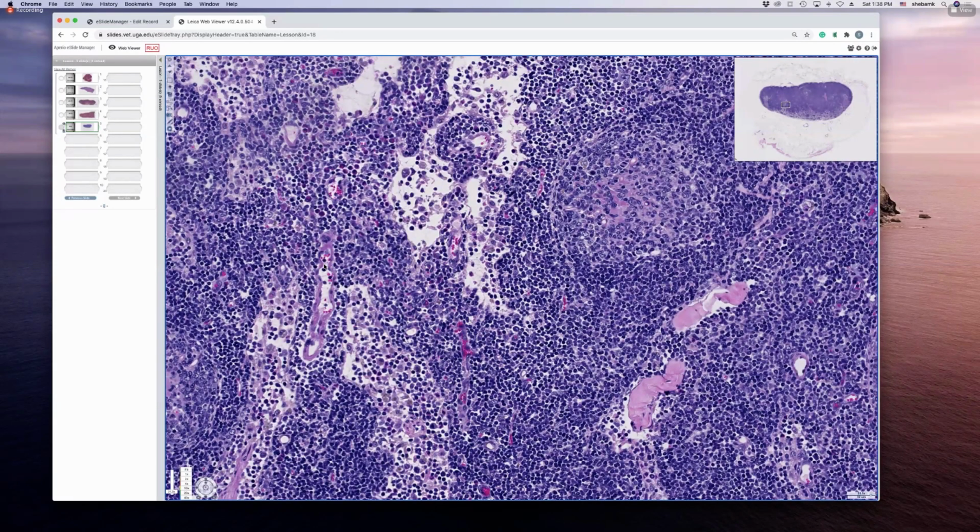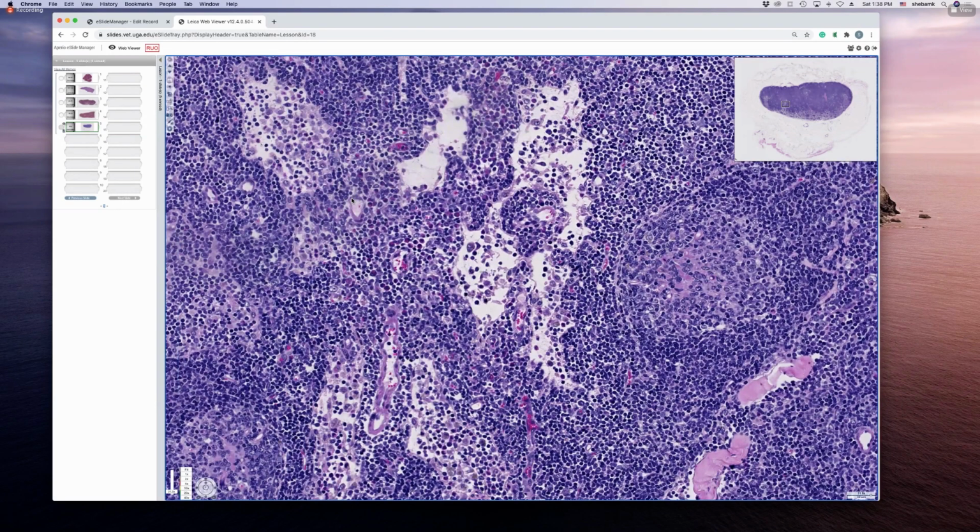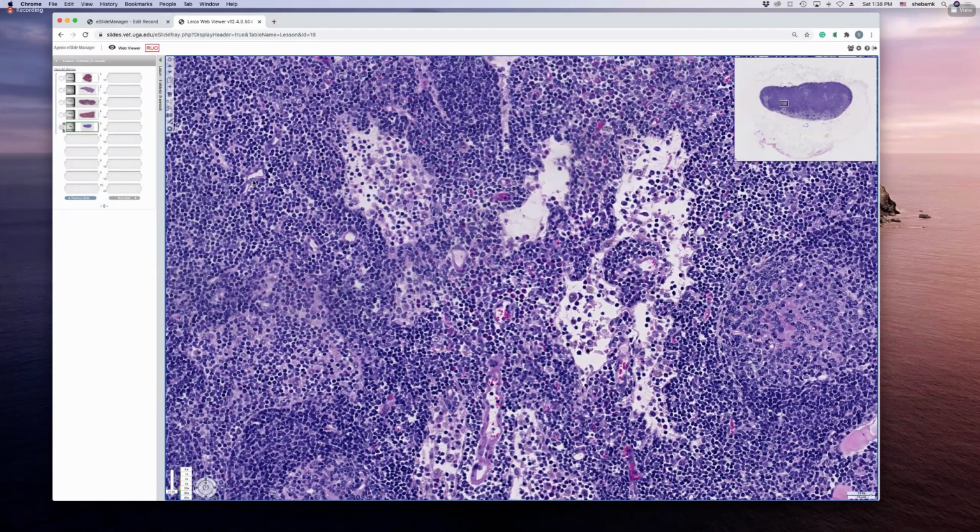But if you look at the endothelium, the nuclei are not flat like you would see in a normal endothelium. The nuclei of these endothelial cells are more prominent, and these endothelial cells are not looking like squamous cells. They look almost cuboidal. So we call them high endothelial vessels.